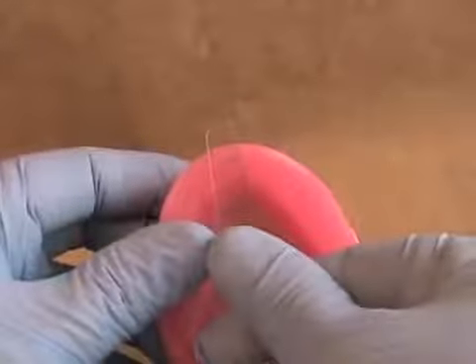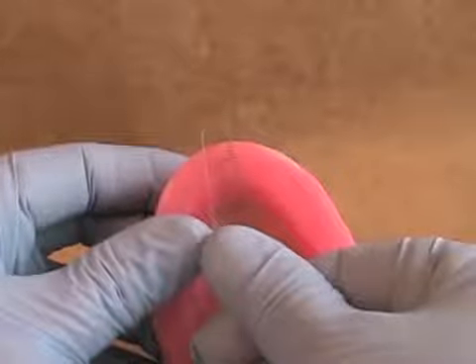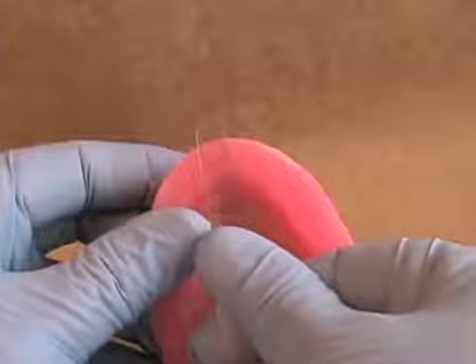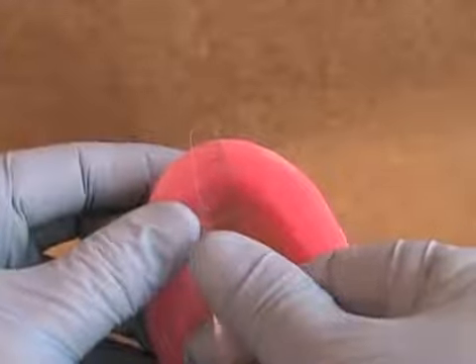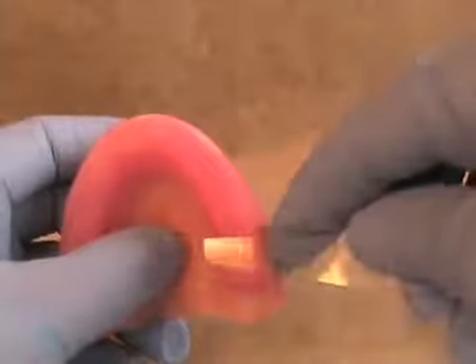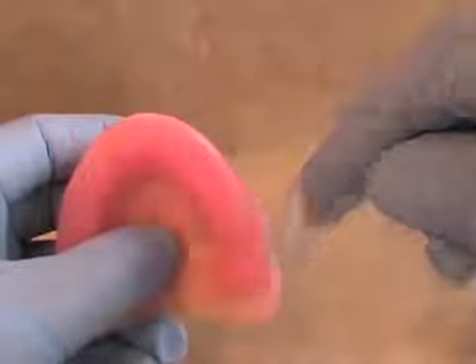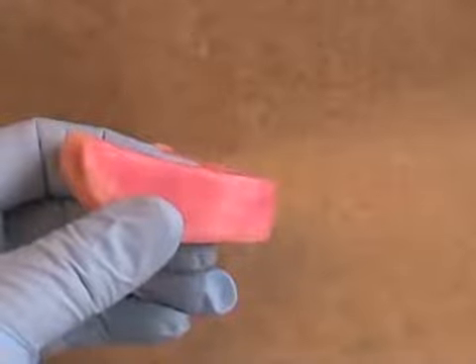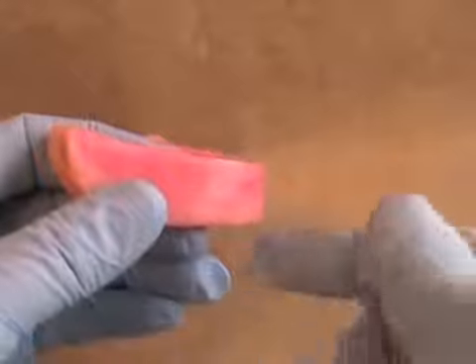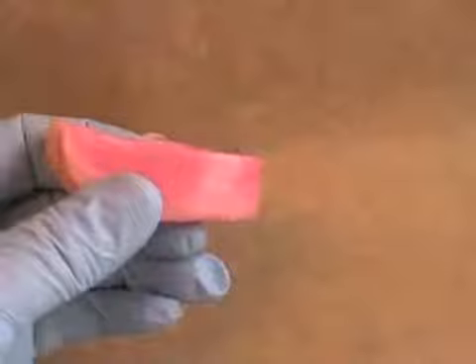Also, in the anterior region, you should have a width of the rim that's about 7 millimeters. That's a little wider than the teeth will be, but we want something nice and broad so that we get a good solid record. You need to tell the patient that the denture teeth will not feel that bulky. In the posterior region, the width of the rim should be approximately 10 millimeters in the maxilla and in the mandible. The mandibular rim should also be slightly angled or proclined in the anterior region, but the height of the rim should only need to be about 18 millimeters. Again, that's just a general guideline.